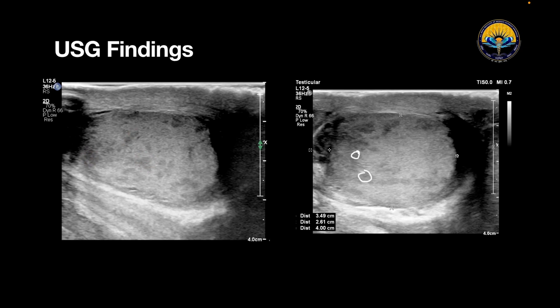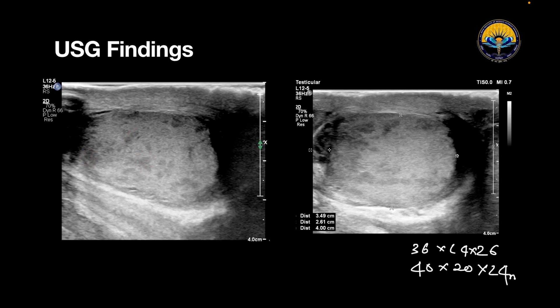Look over here — these are the hypoechoic lesions. The size of both the testes appears to be normal: the right testis is 36 x 24 x 26 mm while the left testis is 40 x 26 x 24 mm. The sizes appear normal, but there is a bilateral increase in size of the epididymis with heterogeneous echotexture.